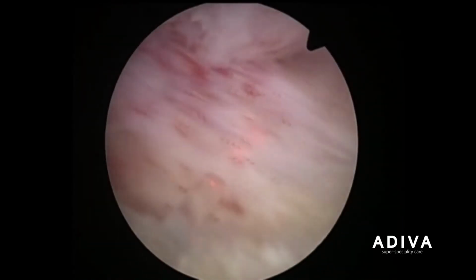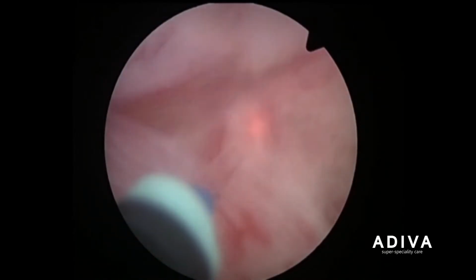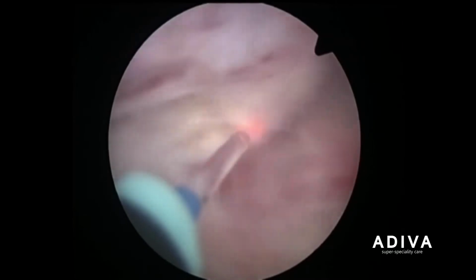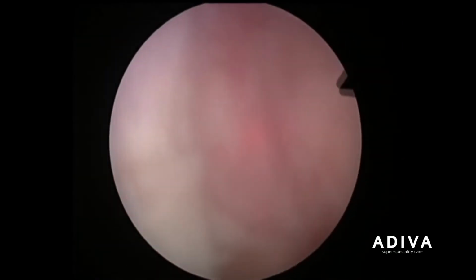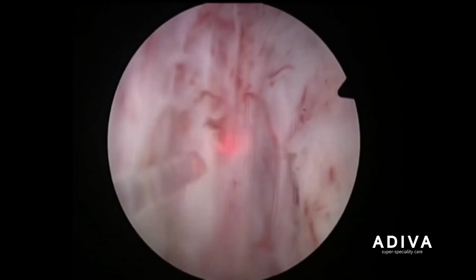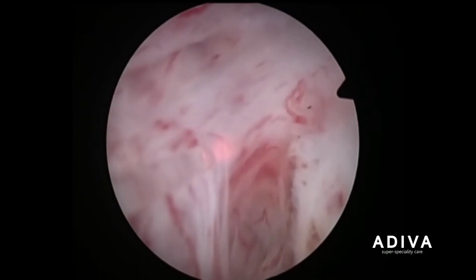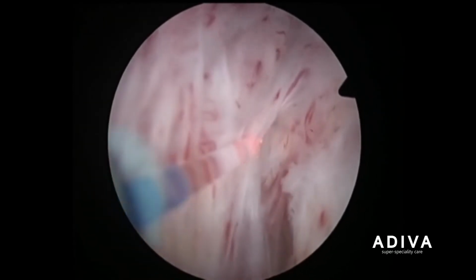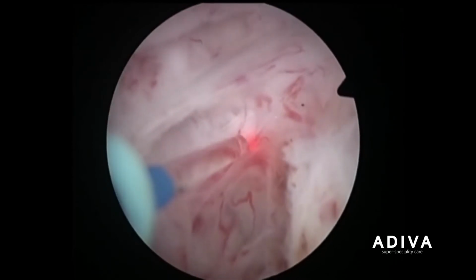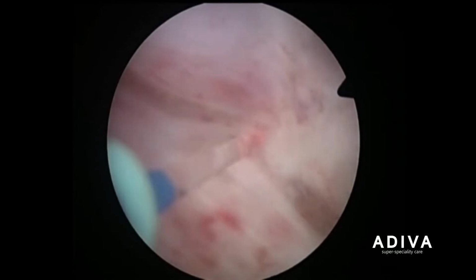You can see the fibers which are transversely seen, white glistening fibers, very well seen here. That is the capsule fibers. And the laser is trying to lift the gland, which is the adenoma. Here we are coagulating the blood vessels very carefully so that the blood loss in this particular procedure is very, very minuscule.